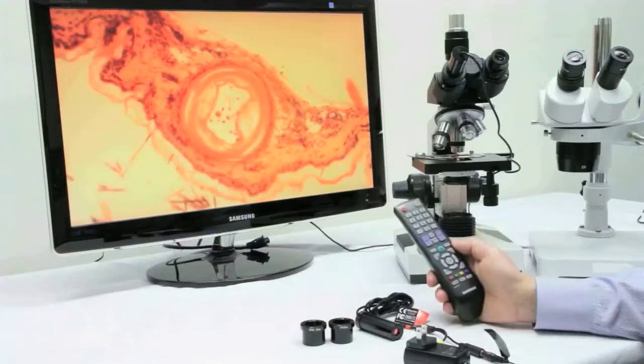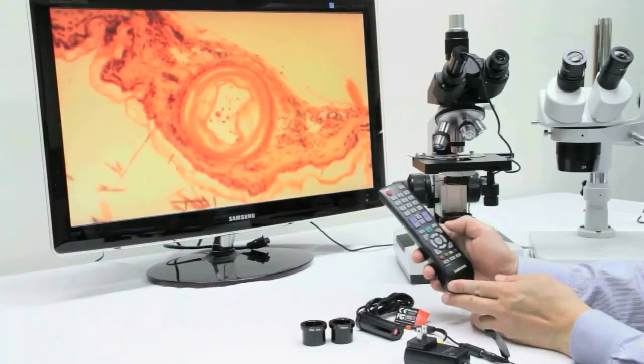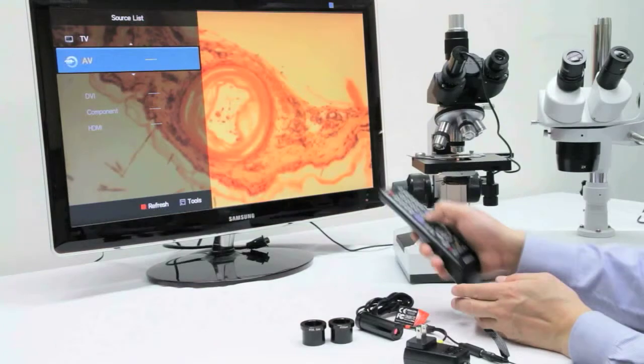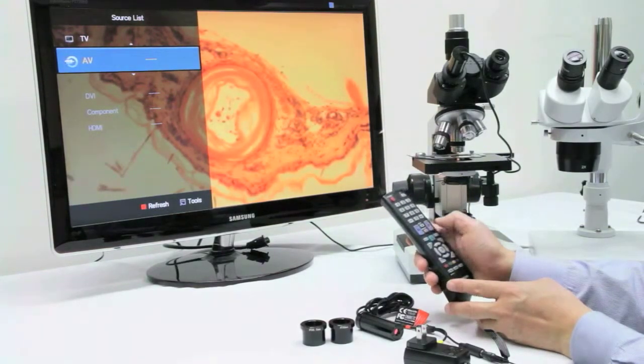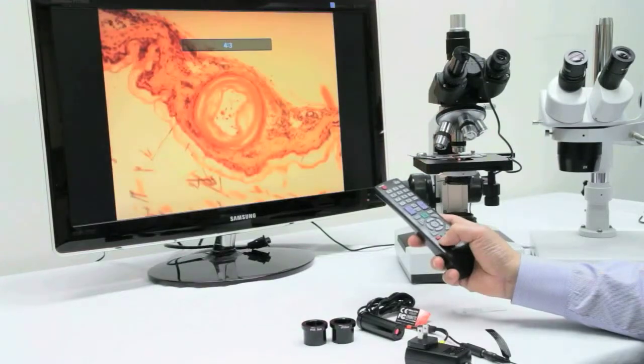After connecting, we make sure we are on the correct input. Generally, this should be under AV mode. Depending on your television, it could also be component mode. You can also select a ratio depending on your preference and your TV's options.